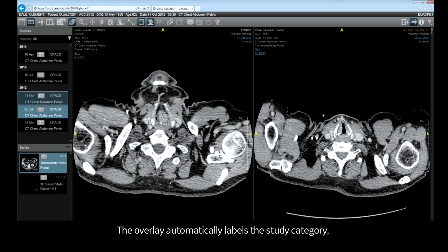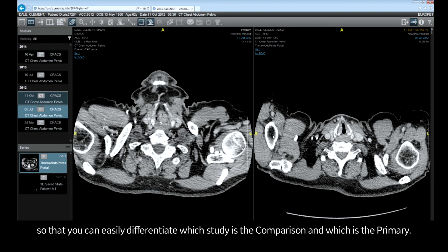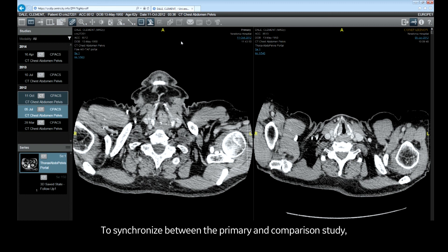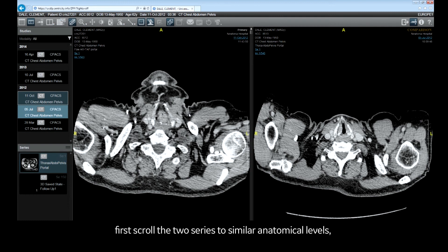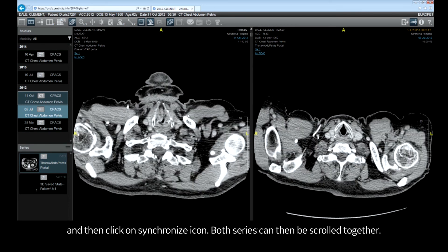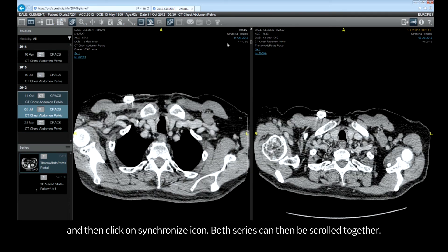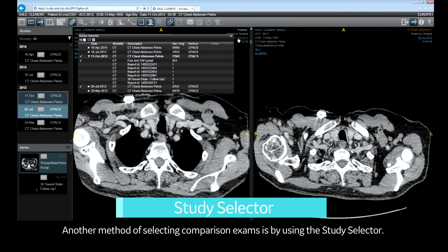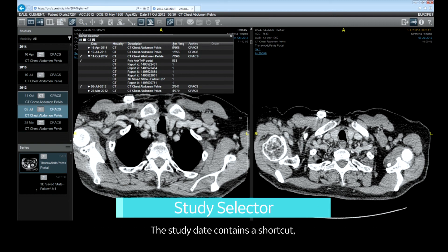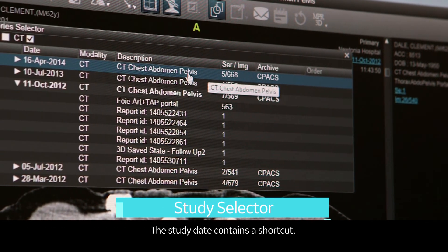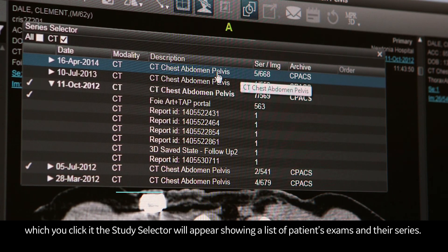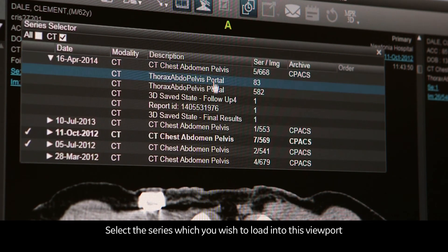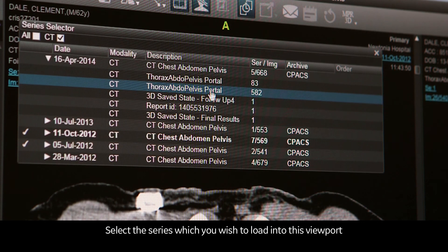The overlay automatically labels the study category so you can easily differentiate which study is the comparison and which is the primary. To synchronize between the primary and comparison study, first scroll the two series to similar anatomical levels and then click on the synchronize icon; both series can then be scrolled together. Another method of selecting comparison exams is by using the study selector. The study date contains a shortcut which you can click to show a list of the patient's exams and their series. Select the series which you wish to load into this viewport.